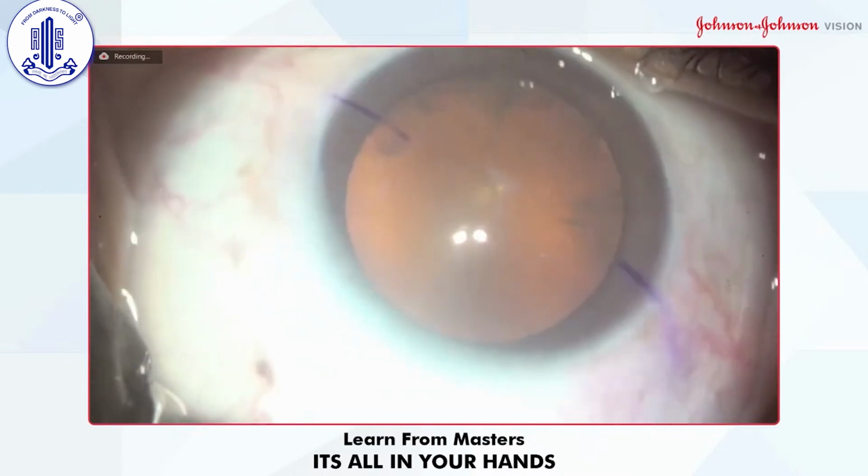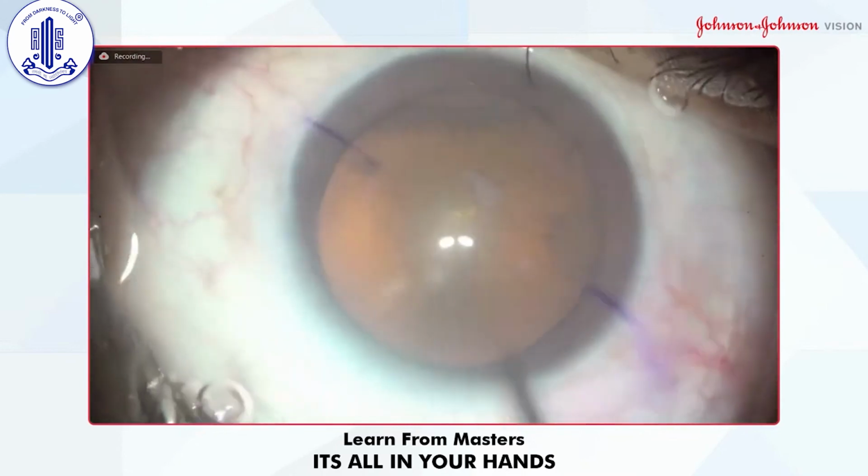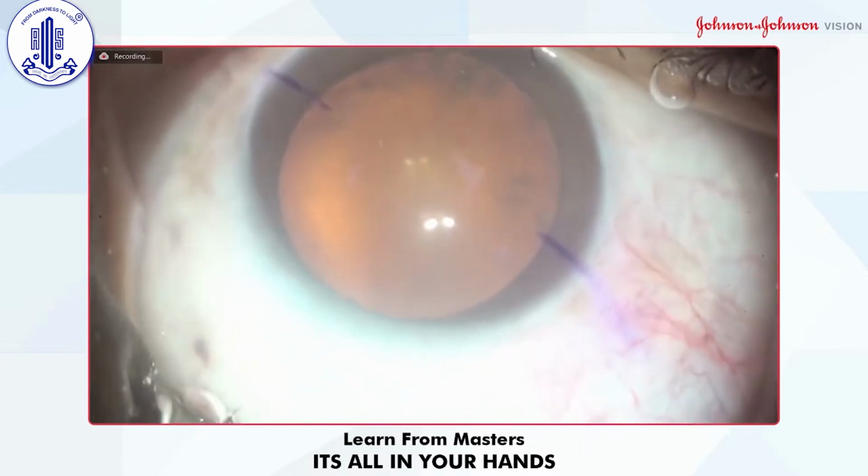So you can see the incision will be roughly 135 here. You can make an exact marking if you want, but to save the time, I'm not going for that marking.